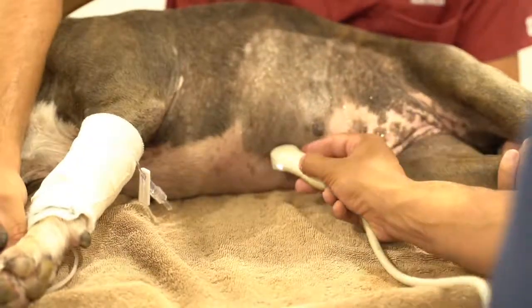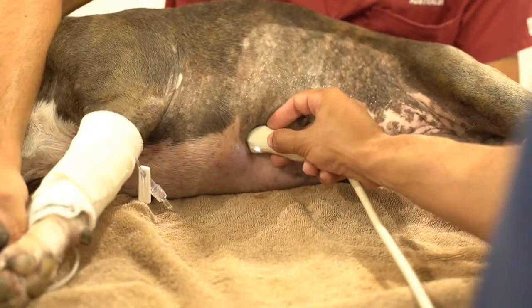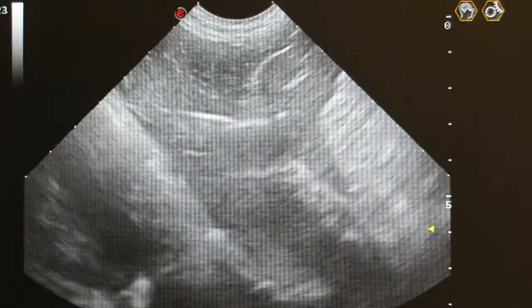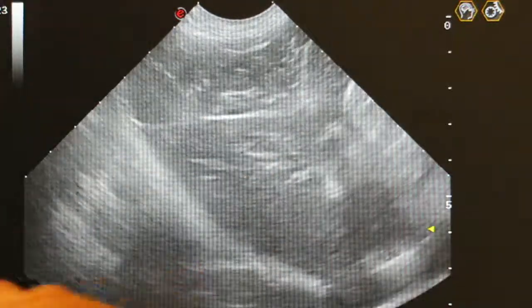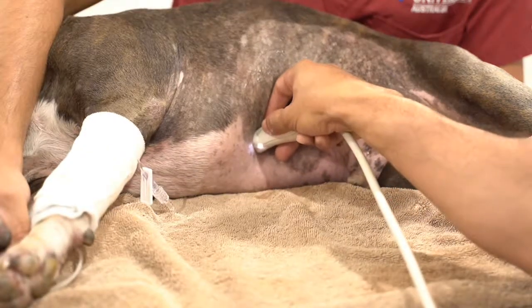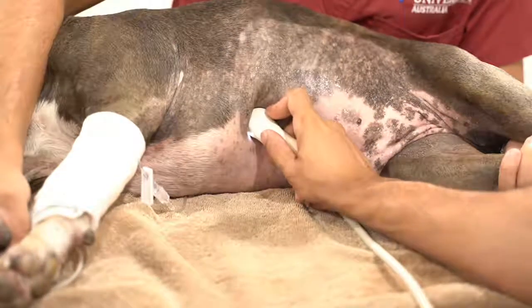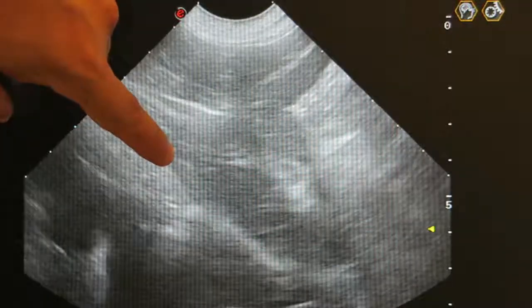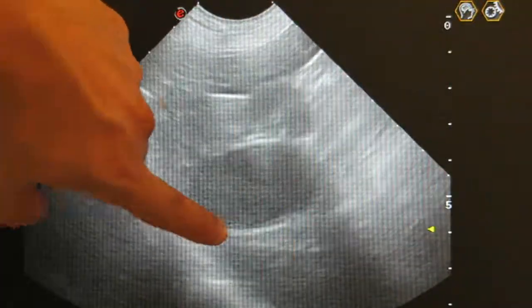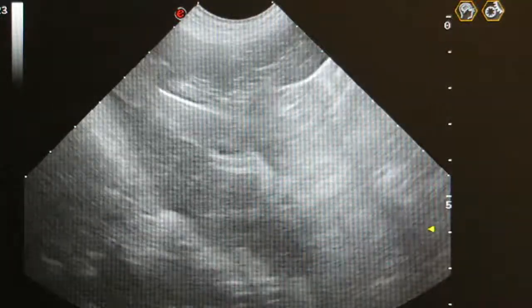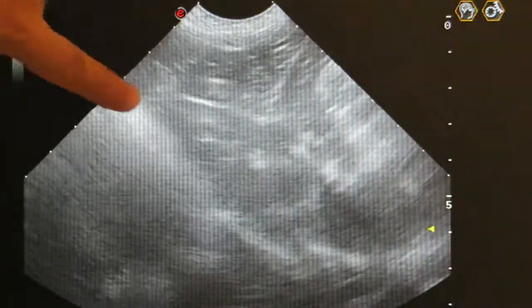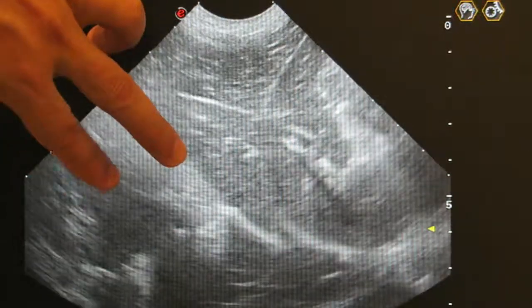Starting at the diaphragmatic-hepatic site, under the xiphoid process. Adjust the depth so that what we're looking at fills the screen. We're looking for any fluid between the liver lobes or between the diaphragm and the liver. Fan side to side — we're not seeing any fluid. We also scan to the gallbladder, which appears intact with no free fluid around it. This view also rules out pericardial effusion; if effusion were present, you'd see fluid and then the heart.